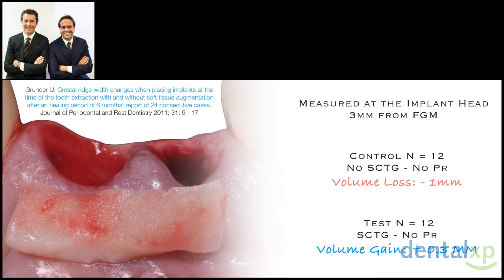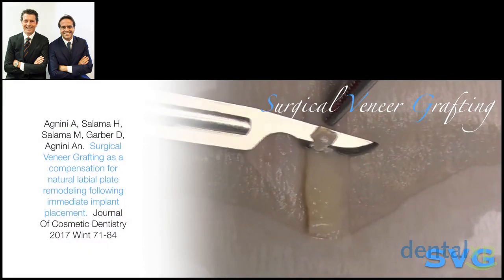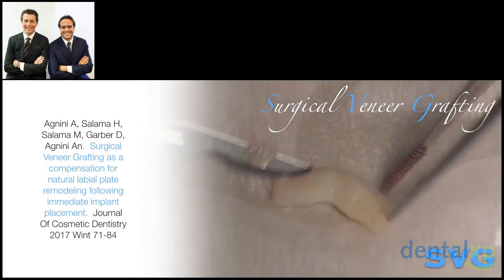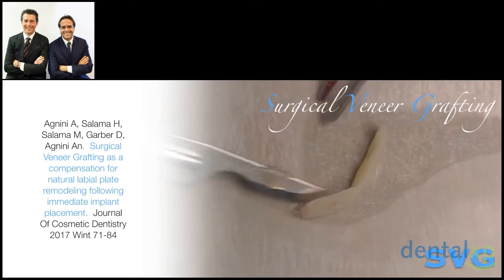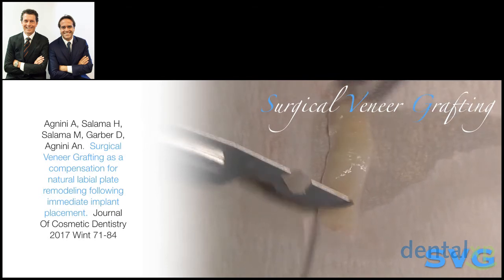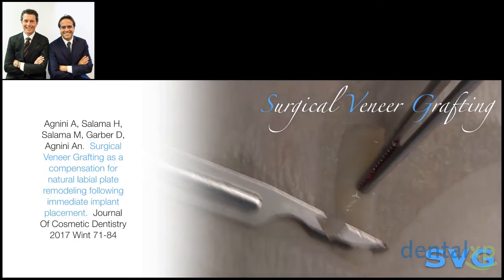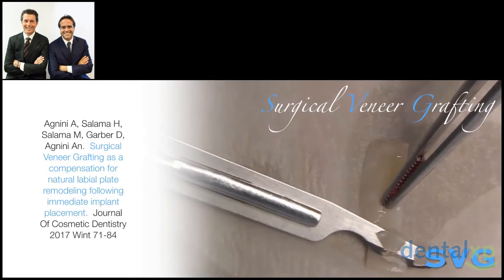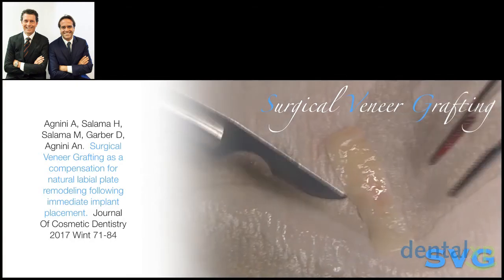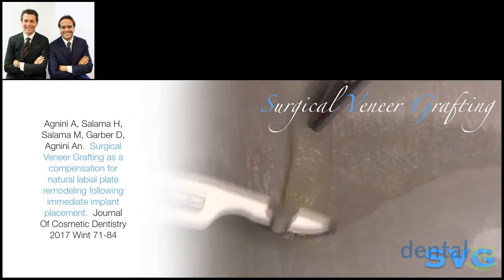And that was one of the reasons why, together with Team Atlanta, together with Maurice and Henry Salama, we decided to create this protocol, which we called the surgical veneer grafting procedure, which basically is a combination of a dual zone bone graft and a connective tissue graft management, which has to be done in a specific way, which we'll discuss in a second. The goal is to limit the buccal contour change after the extraction and potentially enhance the thickness of the peri-implant soft tissue coronal to the implant abutment interface.